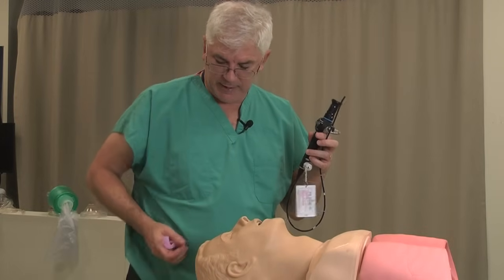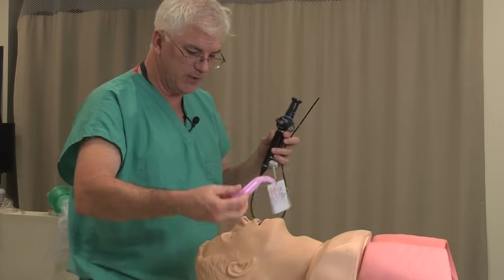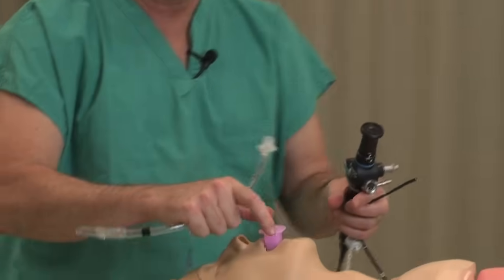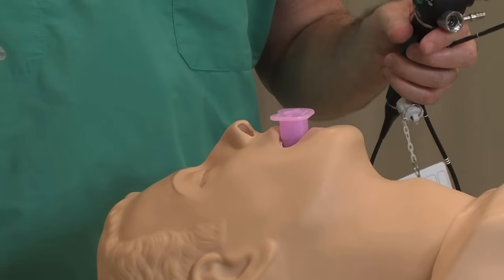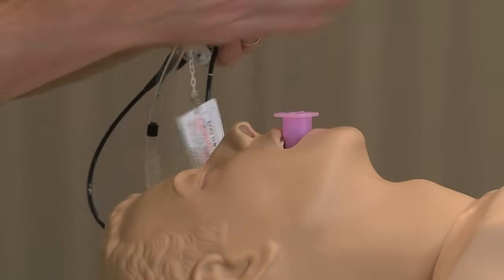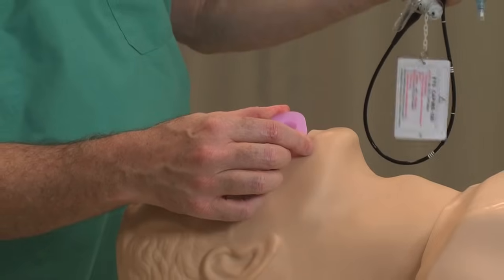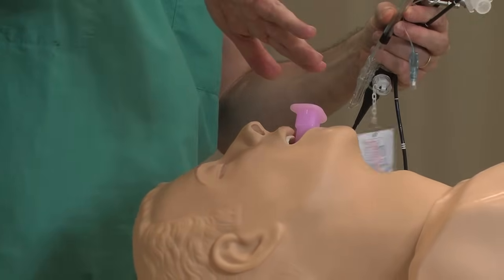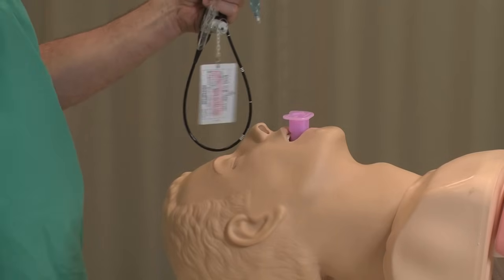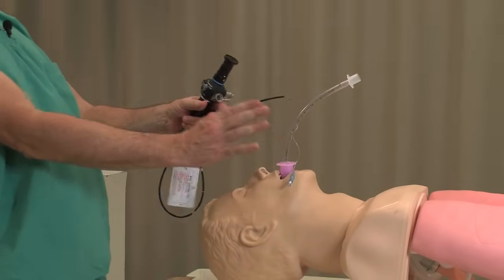You have a choice of airways. I'll explain the difference between them a little later. The patient is well topicalized — I place this in the middle. If when you place it they're still coughing and gagging, it's time to topicalize them some more. One of the key things about doing a fiber optic is making sure the airway is absolutely in the center. If you have it tilted to the side, when you come out you're going to bump against the mucosa and be lost. You want to come straight out looking right at the vocal cords. So I put the endotracheal tube through the center of this, making sure it's absolutely centered.